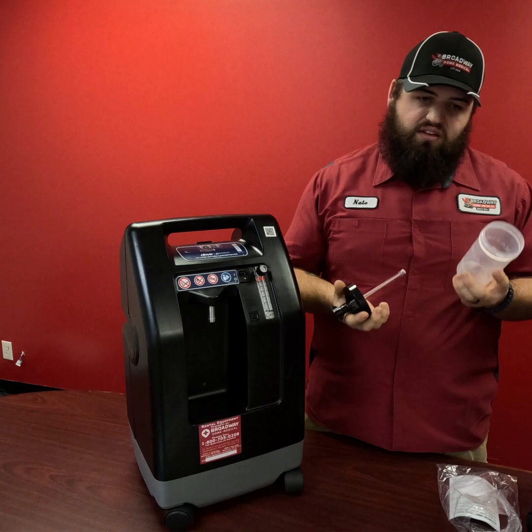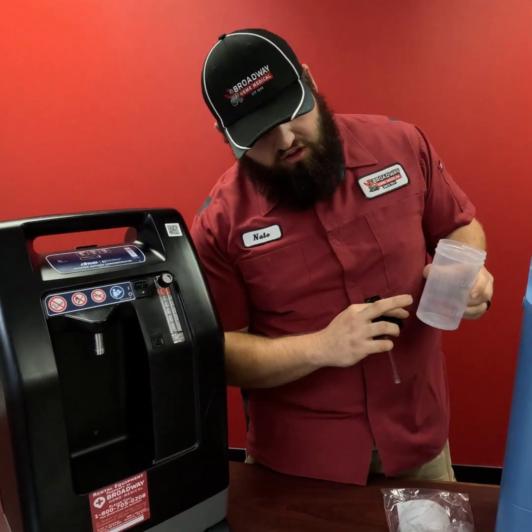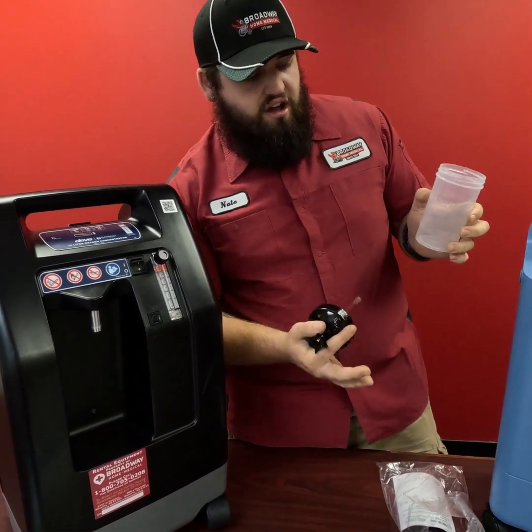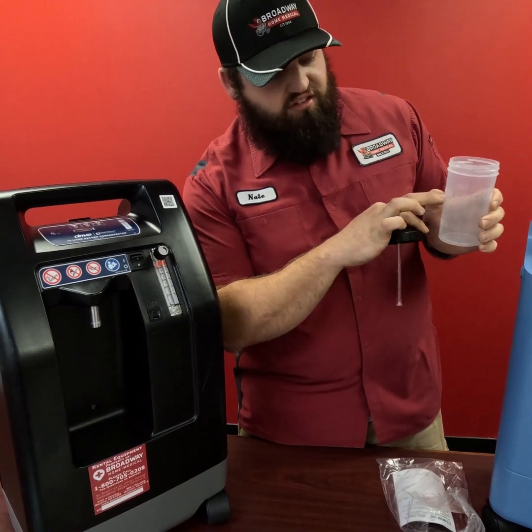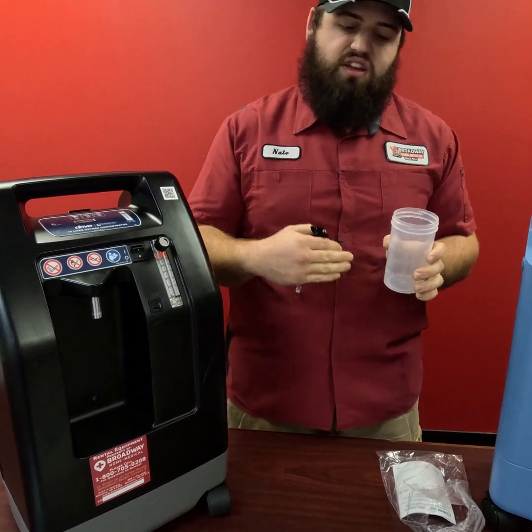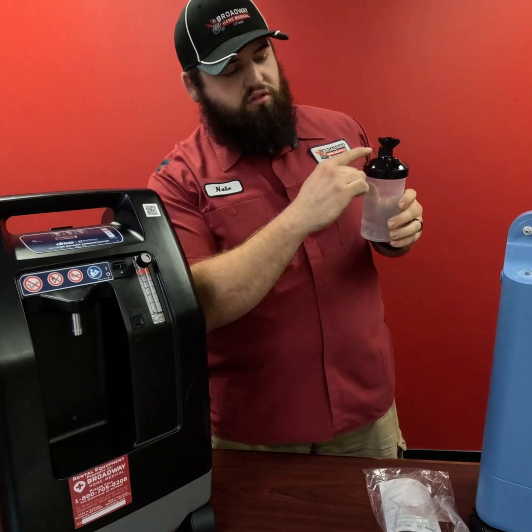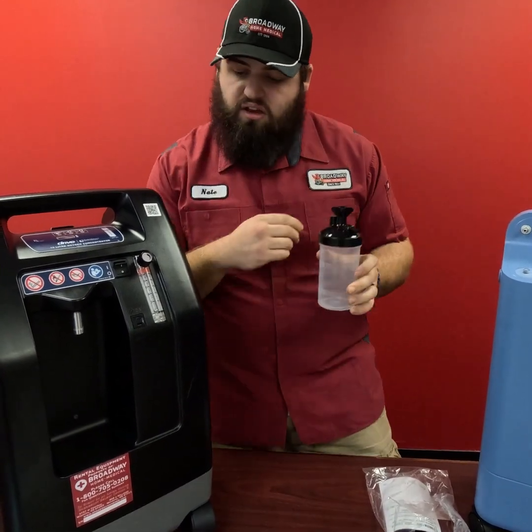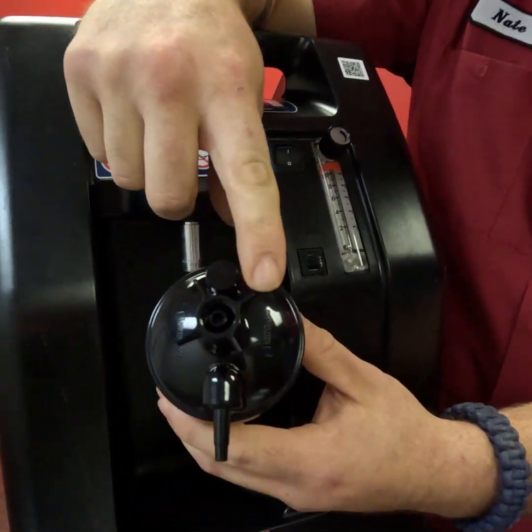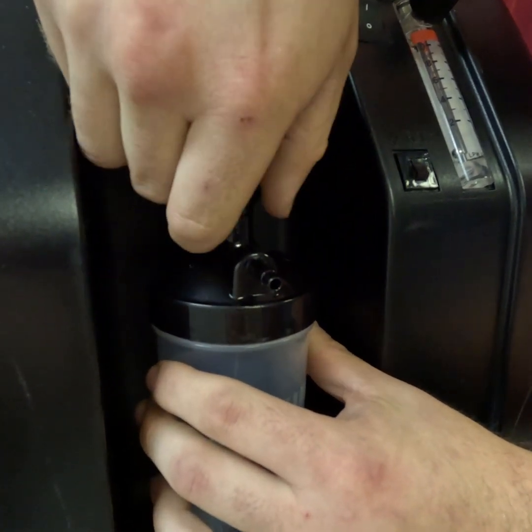So the way that these humidifier jars set up, we have a lid, we have the jar. There's a minimum line and a maximum line on these jars. I always suggest to folks that we stay just under that maximum line. If you do fill up over that maximum line, it can cause what's called spillover, and that's where the water is going to bubble up and into our oxygen line. So from there, we'll take this threaded piece and thread it directly on to the machine.